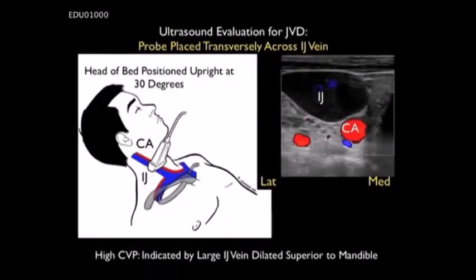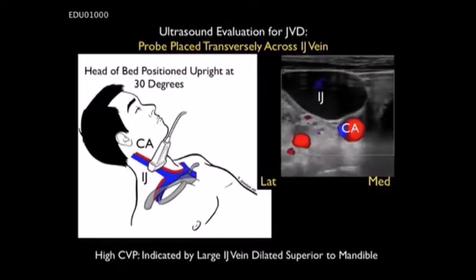There may be times where visualization of the inferior vena cava can be limited by a gas or fluid-filled intestine or stomach.